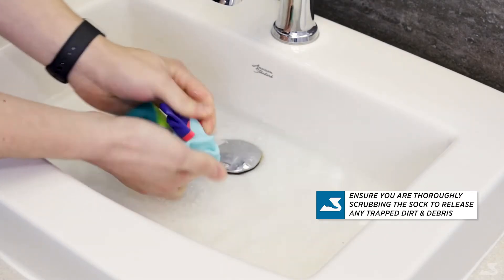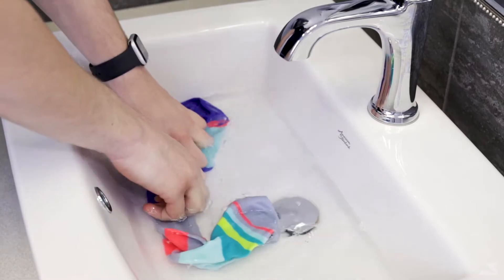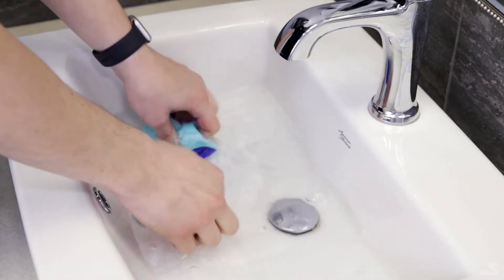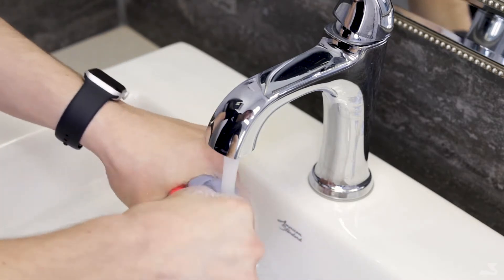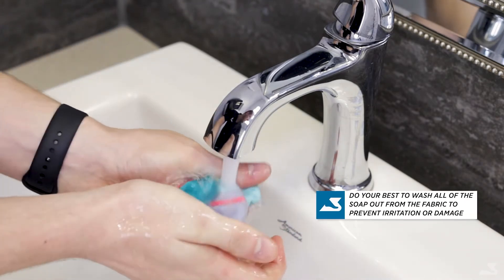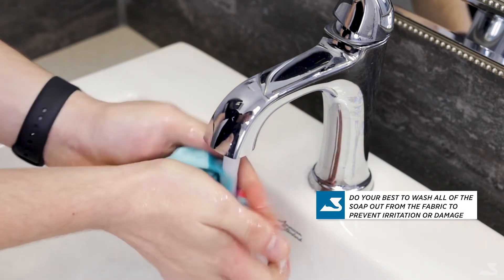You'll notice that your compression garments typically tend to wash easy and quickly. Soak the stocking back in the water and then begin to rinse it under fresh water from the tap to get the soap out of the fabric.